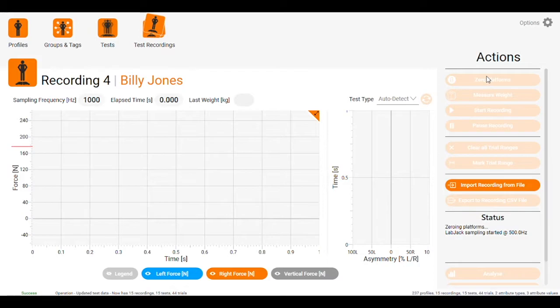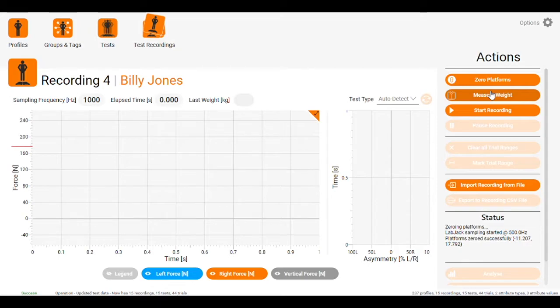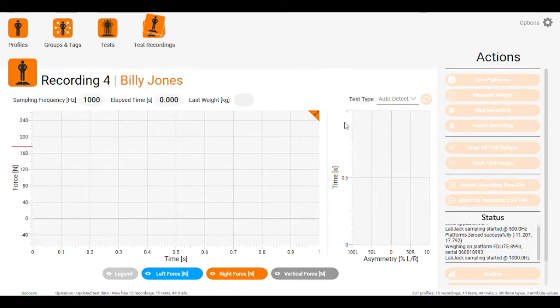There'll be a little text box appear in the middle of your screen. You can't see that on the screen recording. From there, we go measure weight. If we get the athlete to stand on the plates, we get a little bar in the middle of the screen that shows us how balanced we are. When that's approximately 50-50, we press okay.